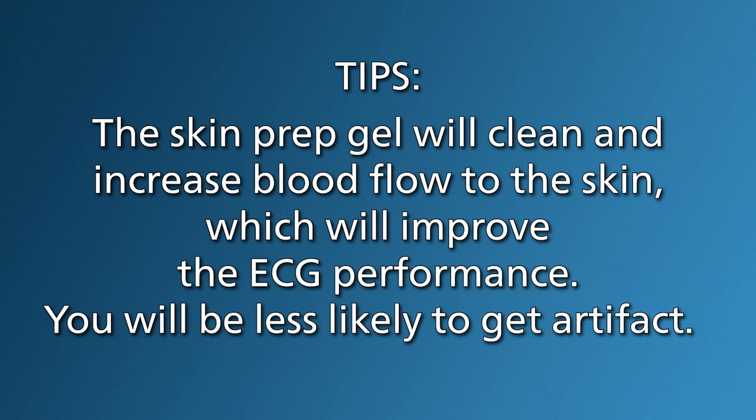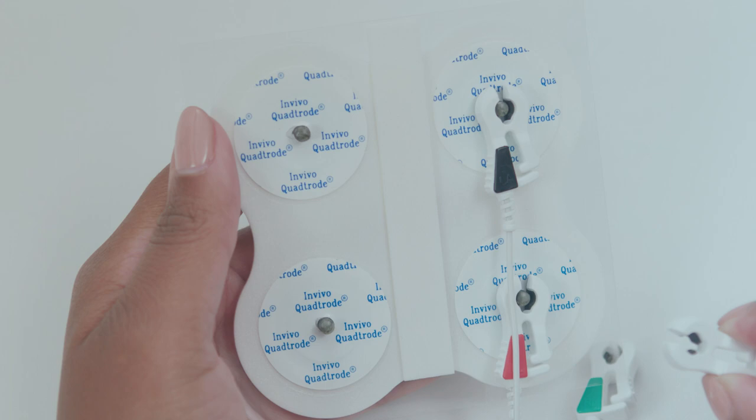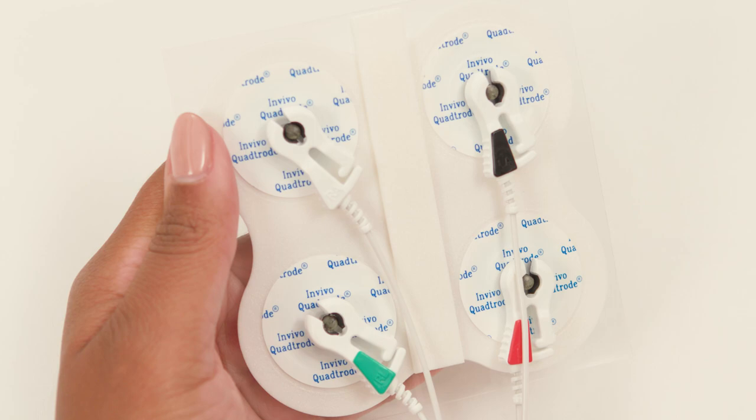Tips: the skin prep gel will clean and increase blood flow to the skin, which will improve the ECG performance. You will be less likely to get artifact. Alcohol swabs break down the conductive properties of the skin and degrade the ECG performance, so do not use alcohol to prep the patient's skin. Tip: connect the electrode cable first to the electrode before placing it on the patient to avoid the electrode gel being pressed out beneath the electrode, which will result in possible less connectivity.